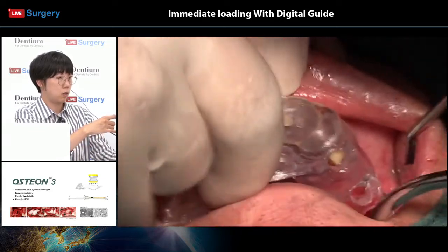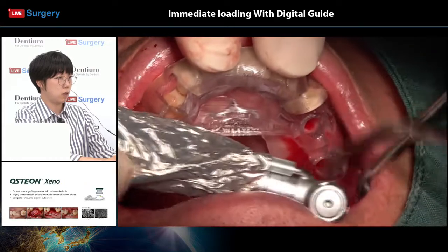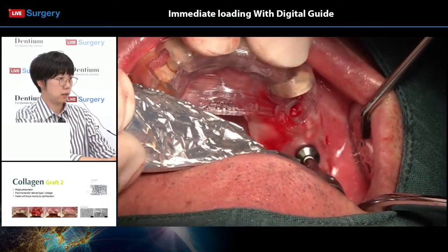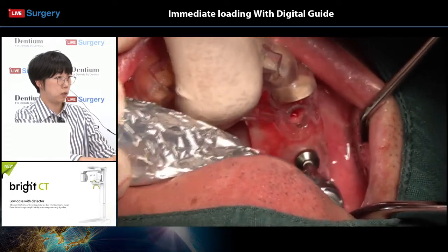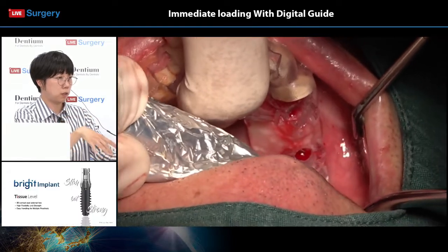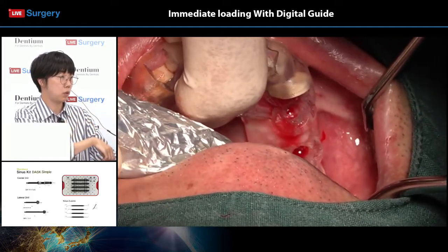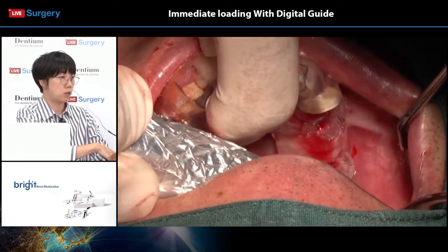So for instance, he would be using an initial drill with 6 millimeter length first to ensure the path of the implant. As I've mentioned before, when drilling, the force is put onto the posterior side of the guide, so the anterior side of the guide might be lifted. So it's always important to secure your guide with your left hand or by using your assistant's hand.